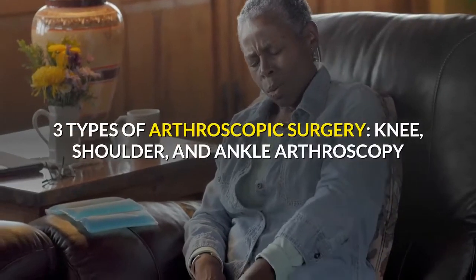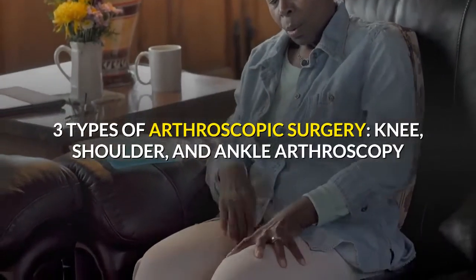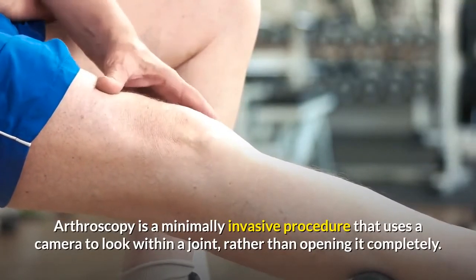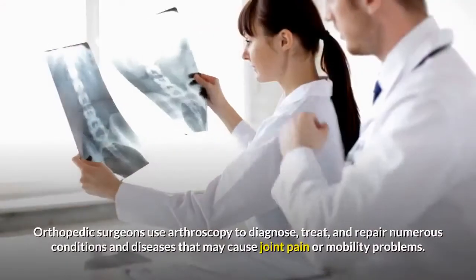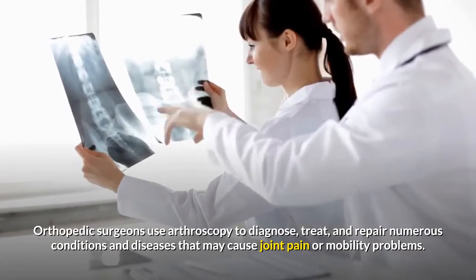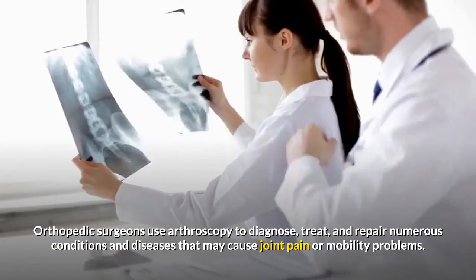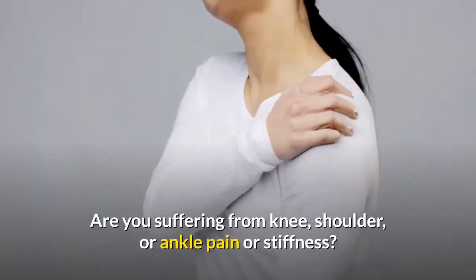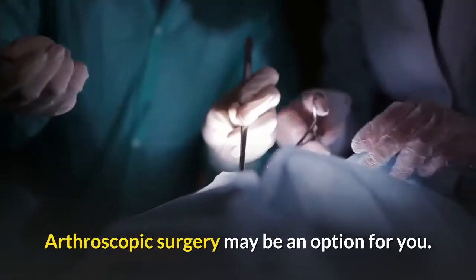There are three types of arthroscopic surgery: knee, shoulder, and ankle arthroscopy. Arthroscopy is a minimally invasive procedure that uses a camera to look within a joint rather than opening it completely. Orthopedic surgeons use arthroscopy to diagnose, treat, and repair numerous conditions and diseases that may cause joint pain or mobility problems. If you suffer from knee, shoulder, or ankle pain or stiffness, arthroscopic surgery may be an option for you.